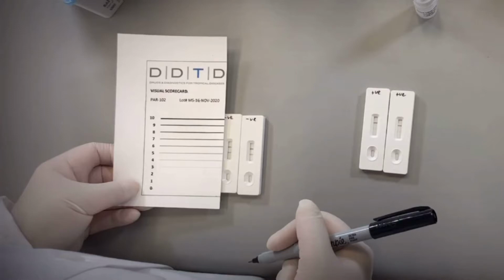One difficulty of working with Buruli ulcers is that the mycolactone is collected from the ulcer with a swab and is then very diluted. To overcome this problem, this assay uses innovative magnetic nanoparticles that can be concentrated with a magnet.